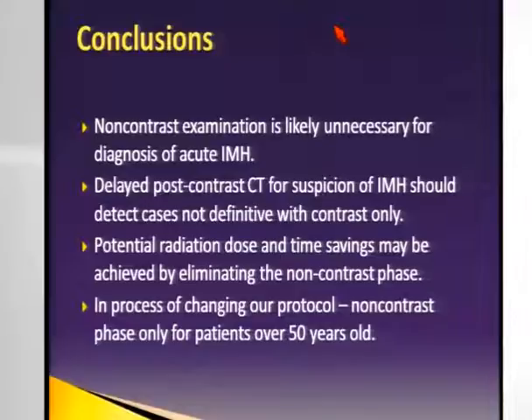We're actually changing to a routine non-contrast phase for patients who are over 50 years old only, and under 50 years old we'll only be doing them as needed.